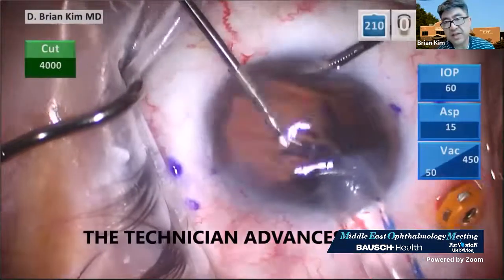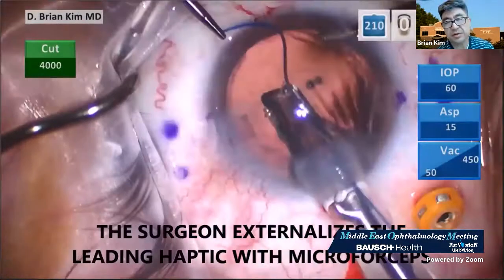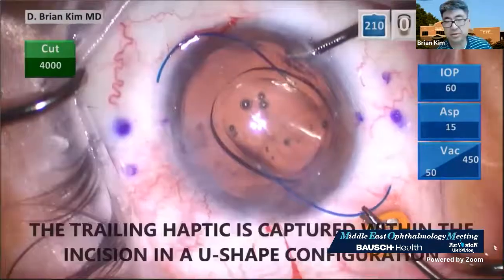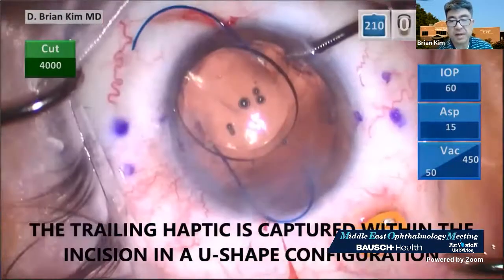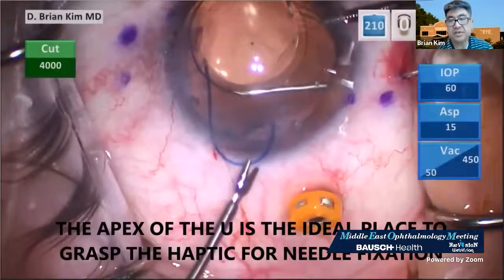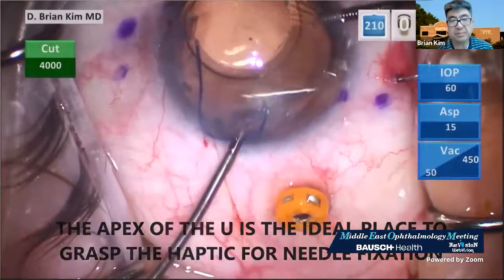So the technician is advancing the IOL for me. I'm externalizing the leading haptic with microforceps. You want to sweep the trailing haptic to the right. The trailing haptic is captured within the incision in a U-shaped configuration. The apex of the U is the ideal place to grasp the haptic.